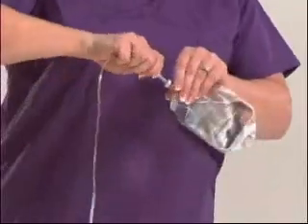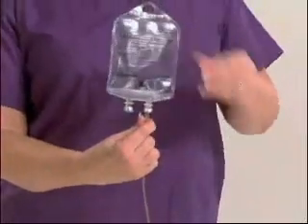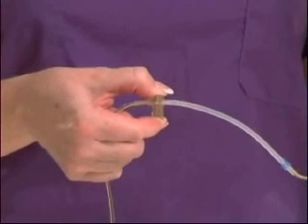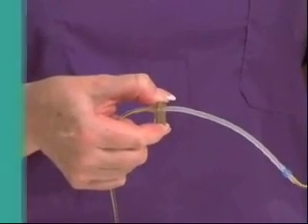Spike the IV bag. If there is any air in the bag, it will be important to remove it before or during priming. Open the slide clamp and then squeeze the flow stop clip to allow fluid to flow through the IV set tubing. Release the flow stop when the line is fully primed.